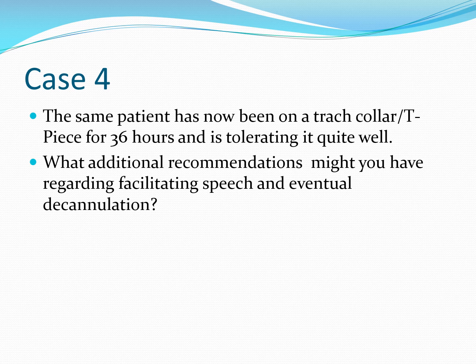36 hours is a little bit questionable. Maybe you want to keep the cuff tube, stick with a cuff tube. But if that 36 hours was more like 3 days, 72 hours, something along those lines, and they've been off the ventilator, they're doing very well, then maybe the vent can be DC'd altogether, and the patient can be transitioned to a cuffless tube.